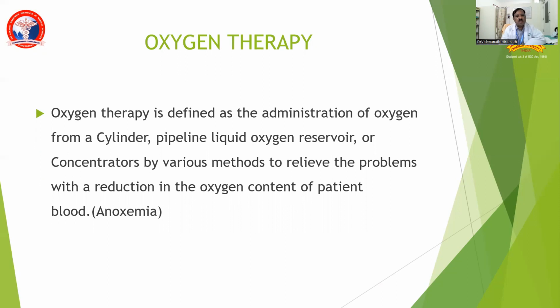So, let us define oxygen therapy. Oxygen therapy is defined as the administration of oxygen from the sources, that is oxygen cylinder, supply from the pipeline, which will come from the liquid oxygen reservoir, sometimes from the oxygen concentrators, by various methods to relieve the problems with reduction in the oxygen content of the blood, that is anoxemia.